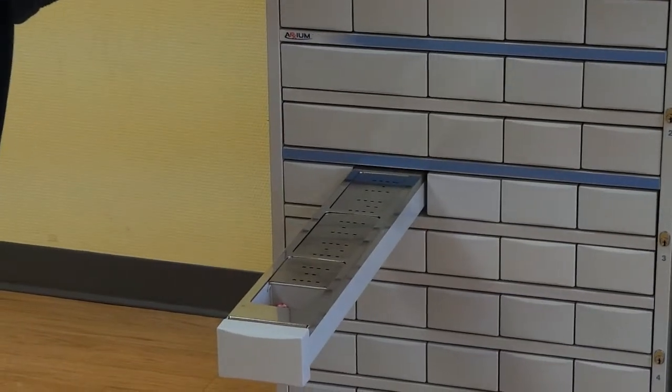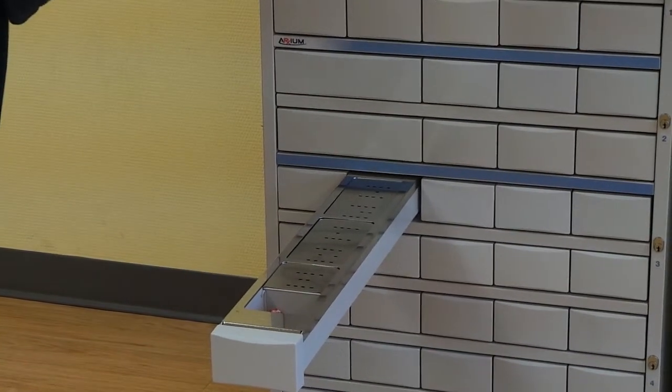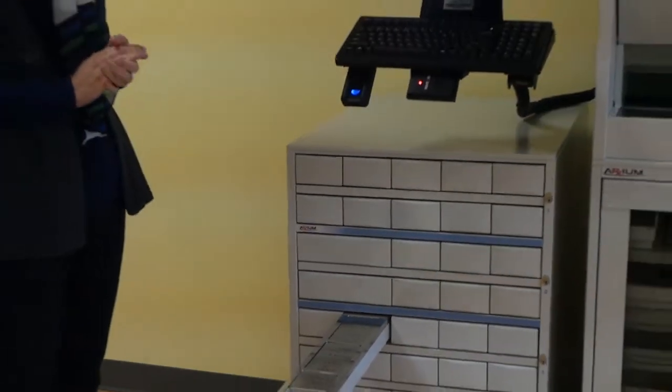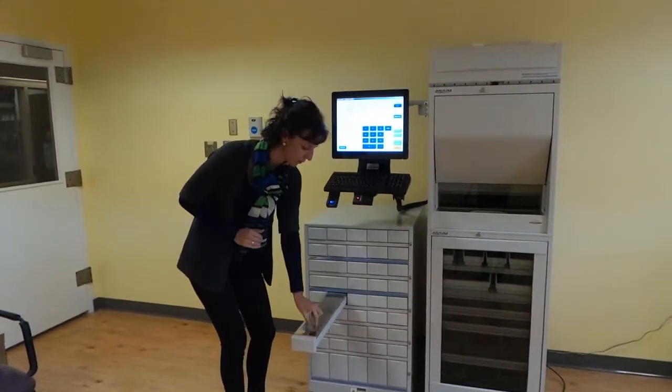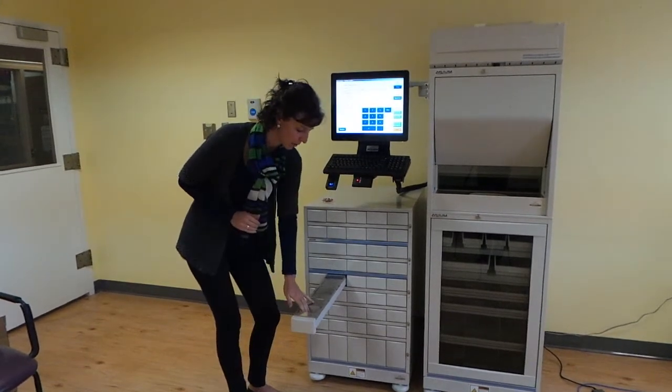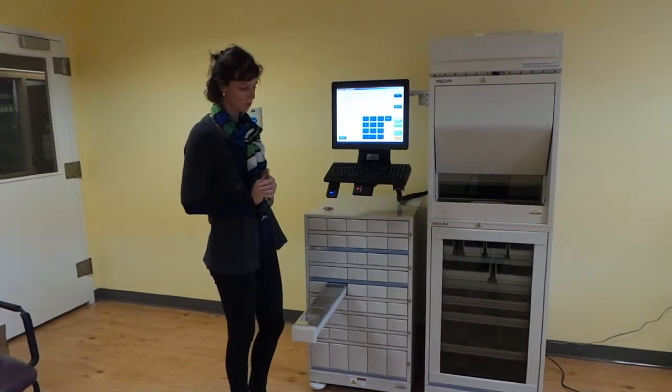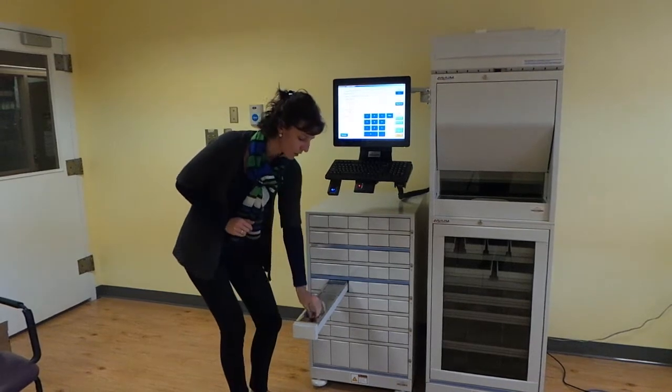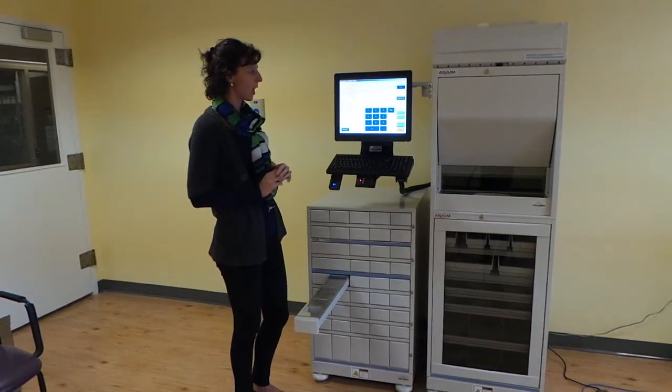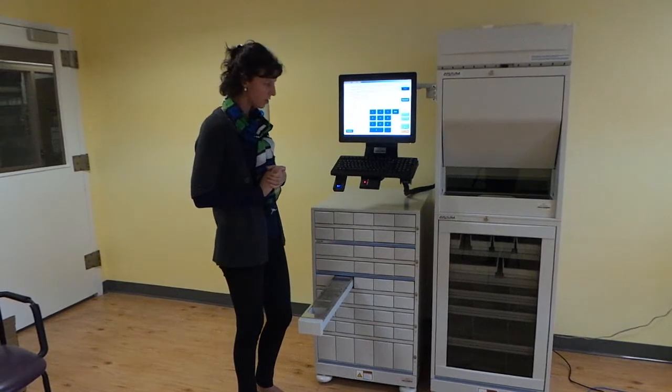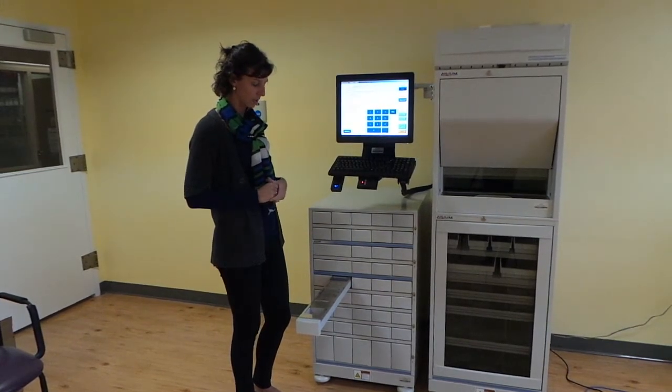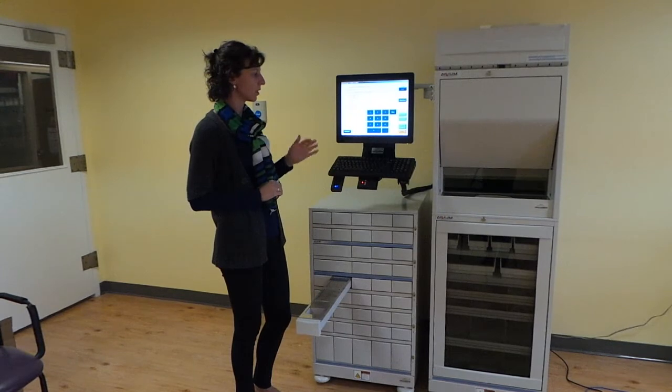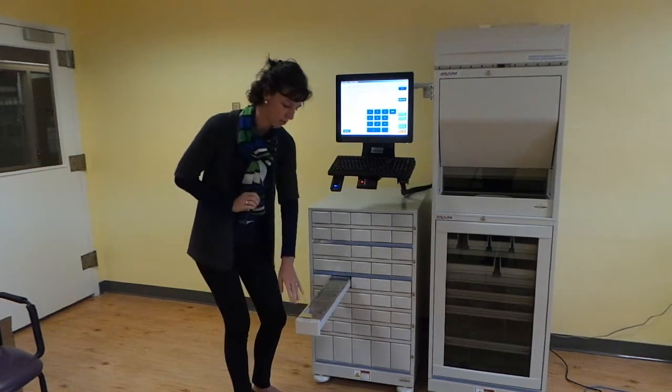Now, narcotics and controlled substances will be prompted to count the quantity that's remaining in the drawer after you've dispensed the medication. So you will simply dispense your medication and count the quantity remaining. There will be a prompt on the screen to enter that quantity. If you did not enter the correct quantity, a message will ask you, are you sure? That's your opportunity to recount the quantity in the drawer. If you continue to enter the wrong quantity, you will create a discrepancy.